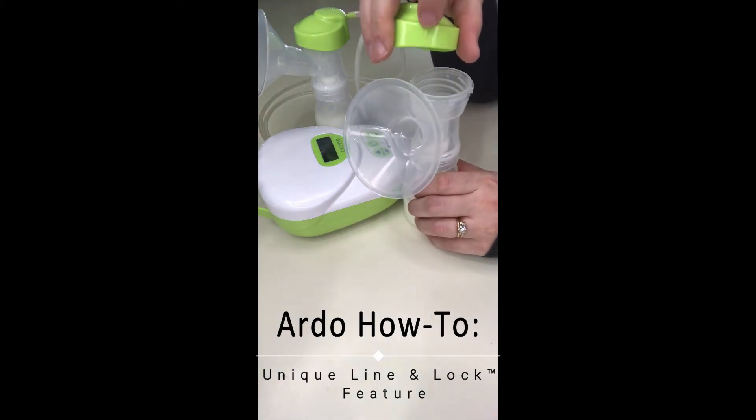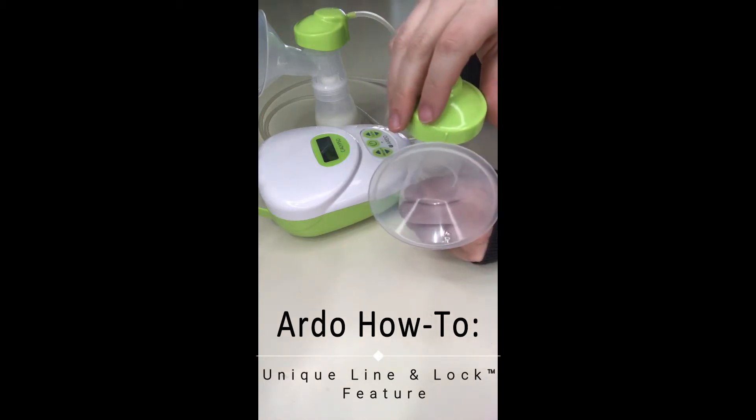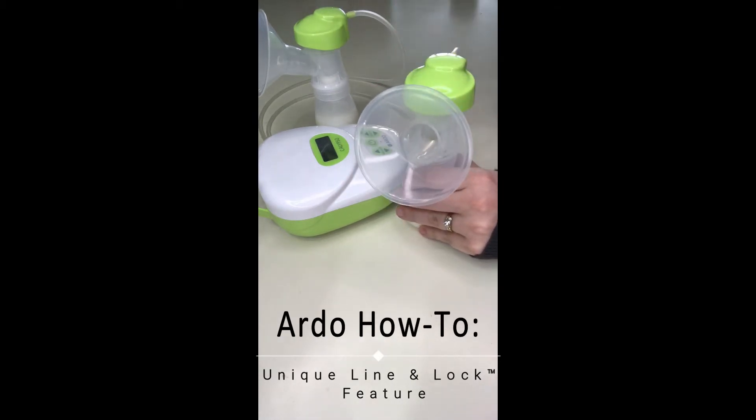On the side of the green adapter cap there's a line, and on the top of the flange there's another line. Make sure that those two lines are lined up, then gently turn and lock.